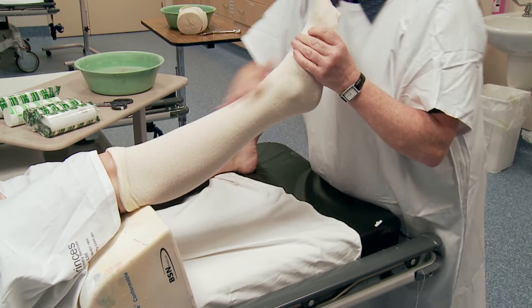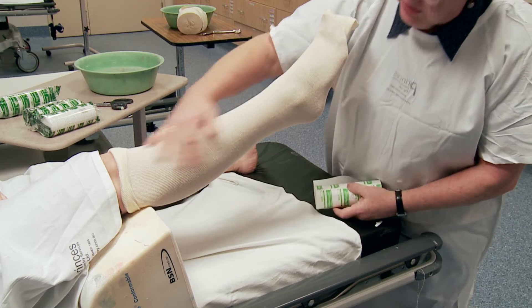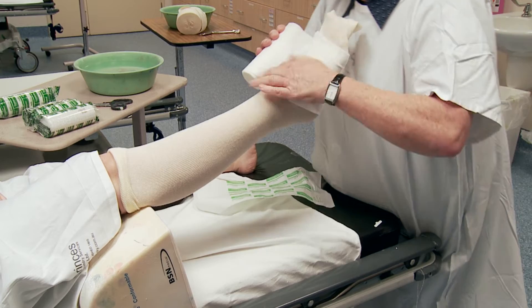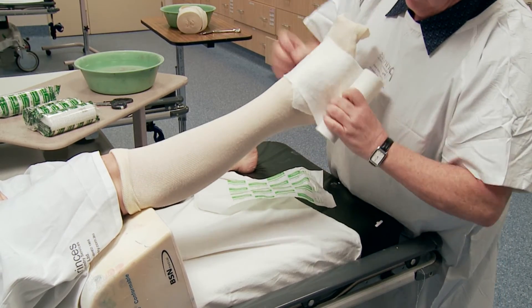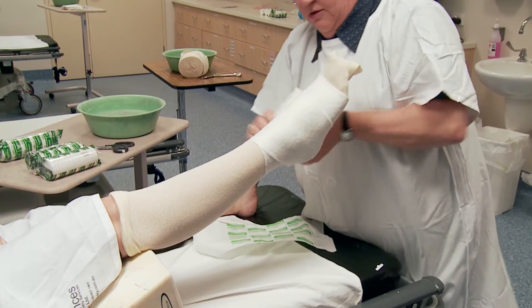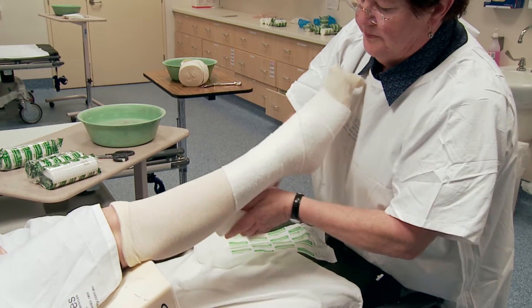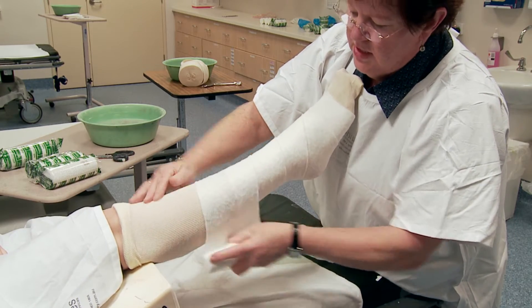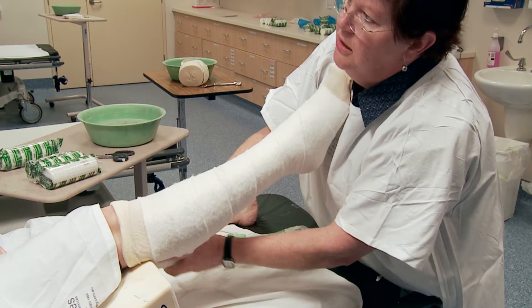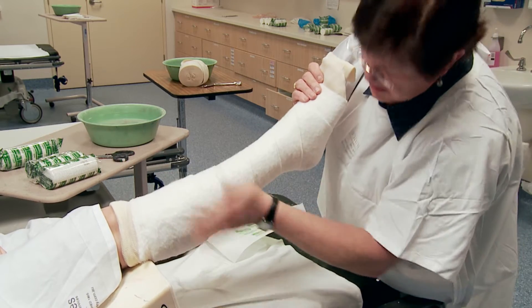Don't stress, it won't go that far, and it will have your toes uncovered. So we get the soft band — make sure there's no wrinkles, no crinkles. Soft band goes below the little toe, and it's one third to cover. Do your ankle, do your heel. Feather it a bit because you don't want wrinkles, one third up. You measure for the bone that's here — it's two fingers down from there, which allows you to bend your knee without any soreness. Nice and firm.